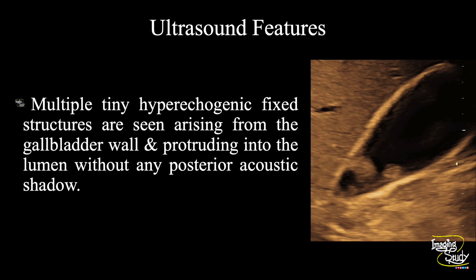In summary, multiple tiny hyperechoic fixed structures are seen arising from the gallbladder wall and protruding into the lumen without any posterior acoustic shadow, indicating them as gallbladder polyps.